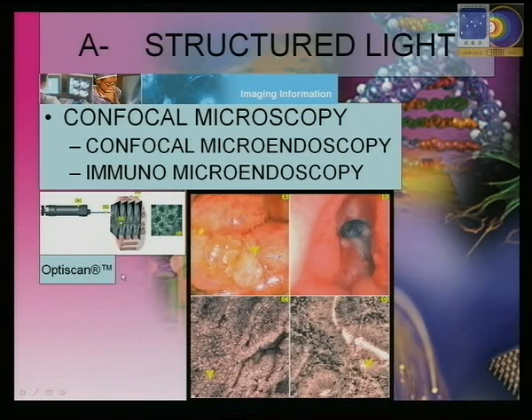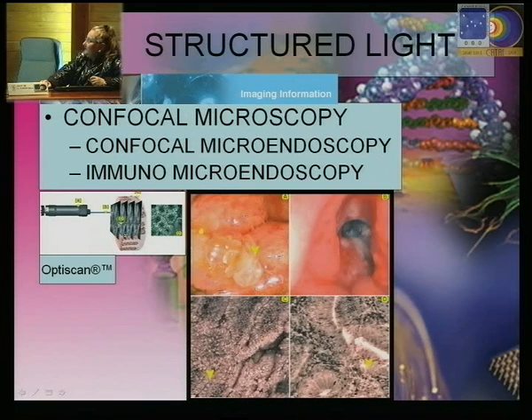The better resolution system, as you have seen, reaching 0.5 microns, is confocal microscopy applied on living tissue, generally with endoscopy.